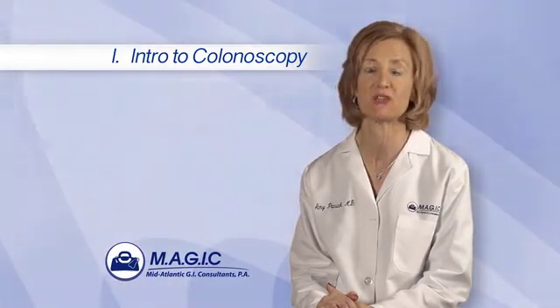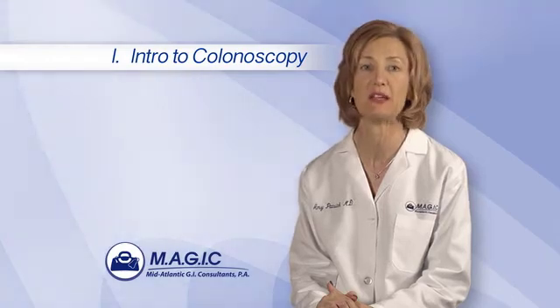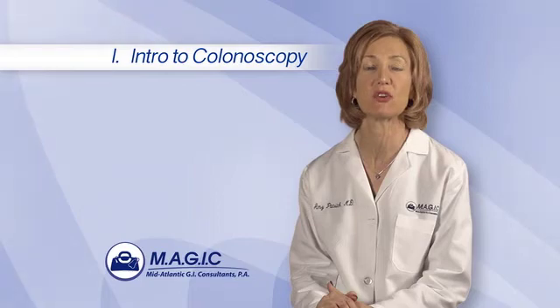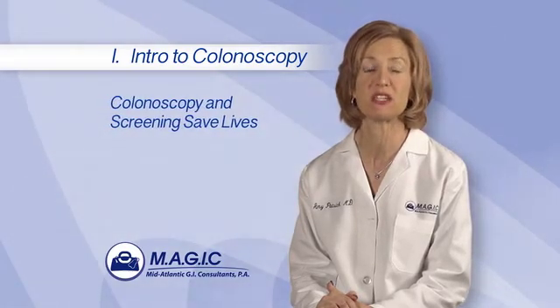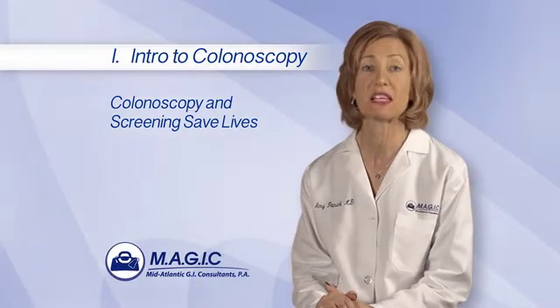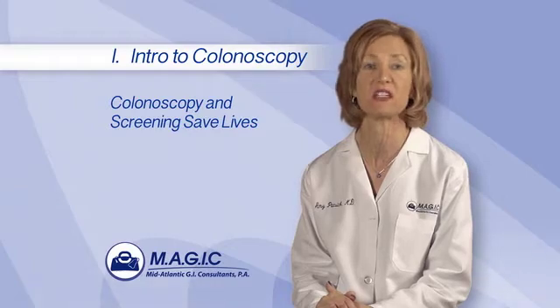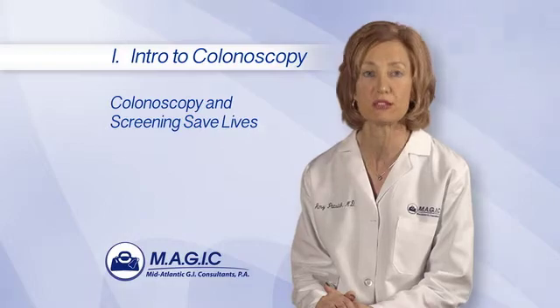consent for the procedure. Colonoscopy is a safe and effective test not only for diagnosing and treating many conditions, including pain, bleeding, and diarrhea, but also for the screening and prevention of colorectal cancer. Colon cancer is the most preventable of the deadly cancers. Unfortunately, only about 50% of patients who should be screened are screened. This lack of screening leads to tens of thousands of deaths from colon cancer in the United States each year. Your decision to have a colonoscopy will help reduce your risk.